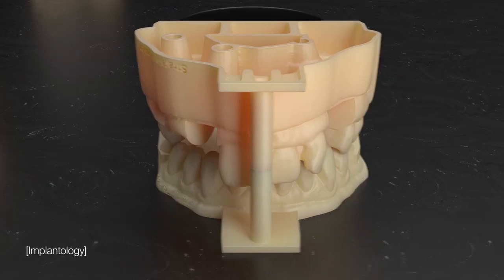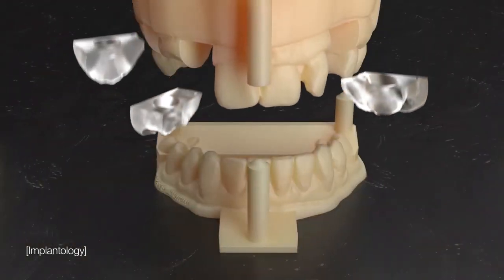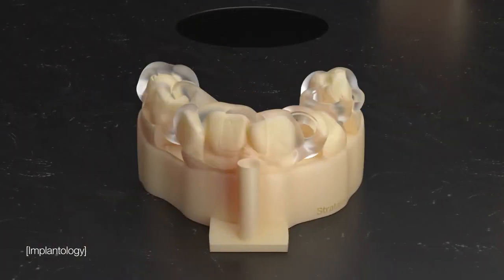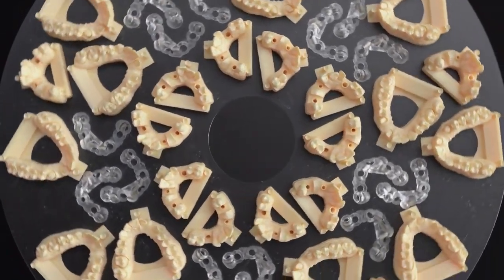The Dentajet is like having three printers in one. Print opaque and rigid implant models, soft gingiva mass, and biocompatible surgical guides, all in one tray in large capacities in a single, unattended job.